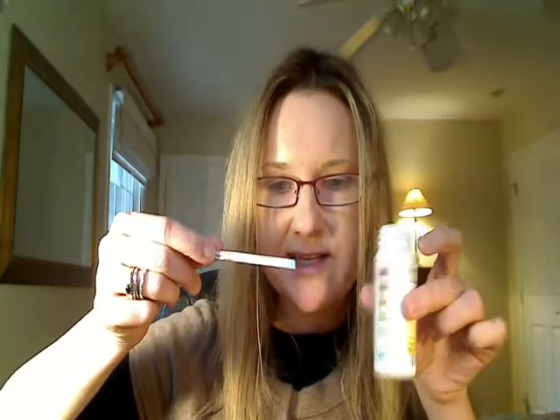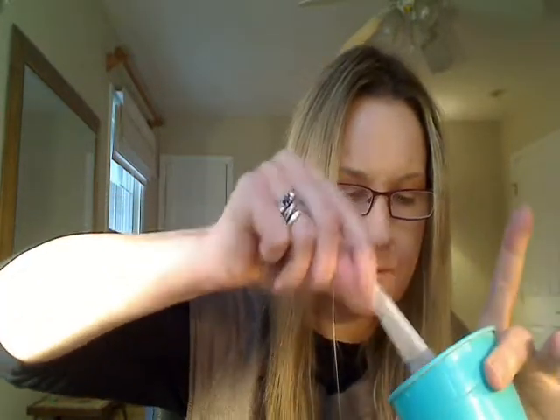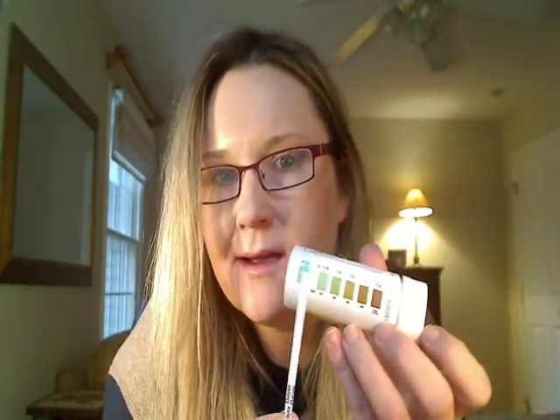Here's my cup of urine, here's the dye stick. I'm dipping it, waiting 30 seconds. Oh my gosh, yay!